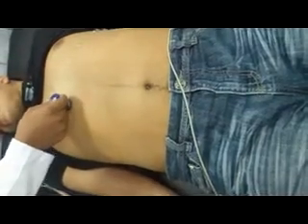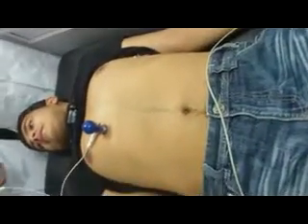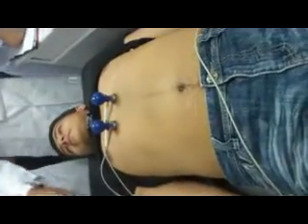Attach. Right and left. What you will do? Do like this, because if there are some hairs, hair side, then you do. Now V2, you attach V2. Not V3. First you attach V4.